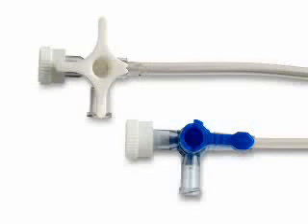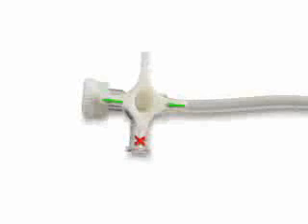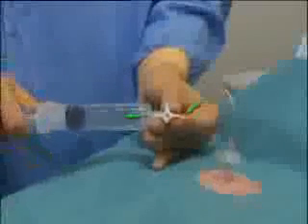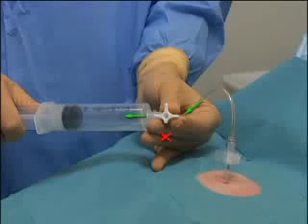Numerous models of stopcocks exist, and you should be familiar with those used in your institution. The 3 white arms of the stopcock used in this video point to an open side port, while the side without an arm points to an obstructed side port with a closed end. When air is being aspirated from the pleural space, the stopcock should be open between the patient and the syringe, but closed to the ambient air.